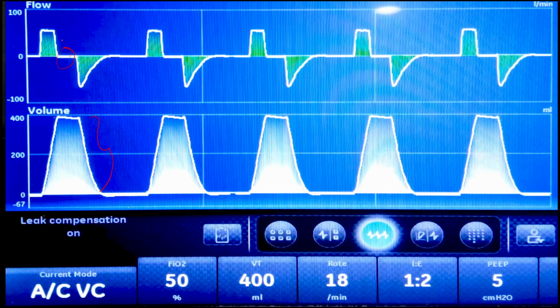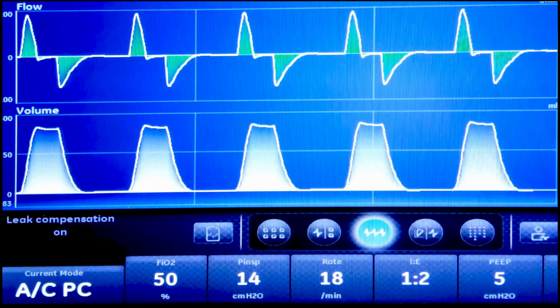This is the space when the plateau gets set, and it gets represented on the pressure scalar as the inspiratory pause. That is the time duration when you are able to get an idea of the plateau pressure in a patient on a pressure time scalar. But this is how the volume and flow time scalar would look in a patient on volume controlled ventilation.